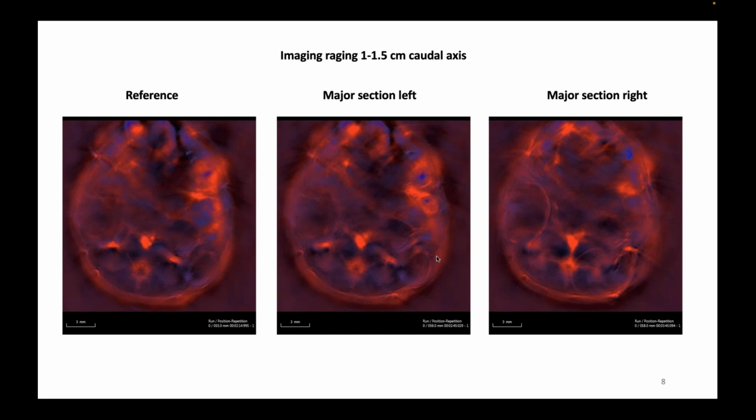So you could see the tumors, or it was pointless. I was putting the animal inside the chamber and looking for the wider section of the tumor, which in this case, as you can see here, was at 56 millimeters, and my reference point was at 55 millimeters. So they were 1 millimeter away.